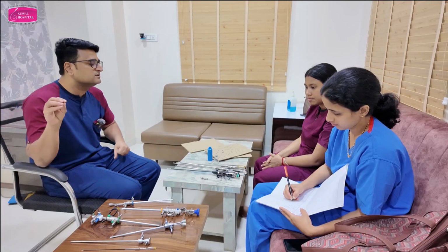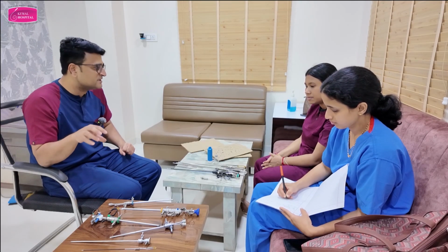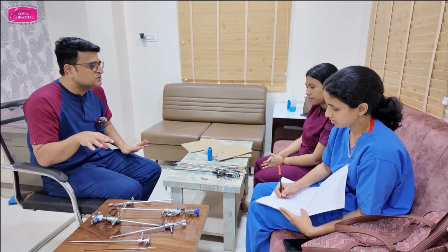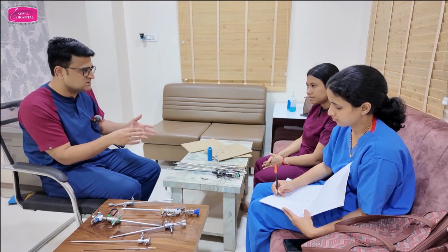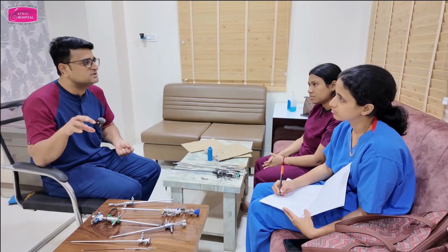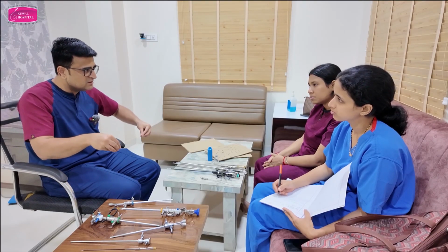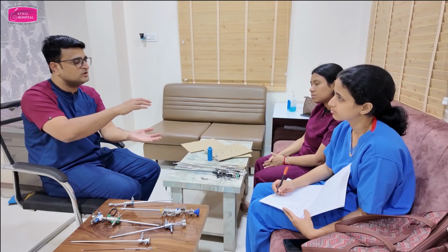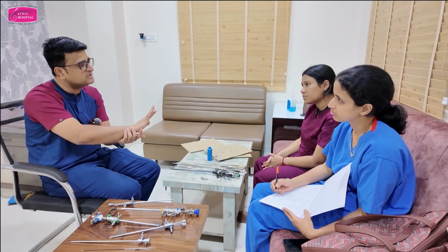So we usually set the hysteromat pressure between 45 to 95. 95 is mean arterial pressure. Got it? So whenever I am doing hysteroscopy, I will set between these two depending on the leak, patulous os. Whenever you are introducing the hysteroscope, if you are getting distension at 60 pressure, it's okay, no need to increase. But if you have kept pressure 60 and still the uterine cavity is not distending, that means the hysteromat is showing 60, but there is some leak because of which the inside pressure is not 60. Because if inside pressure is 60, the uterus will distend. As the uterus is not distending, that means inside pressure is not 60.